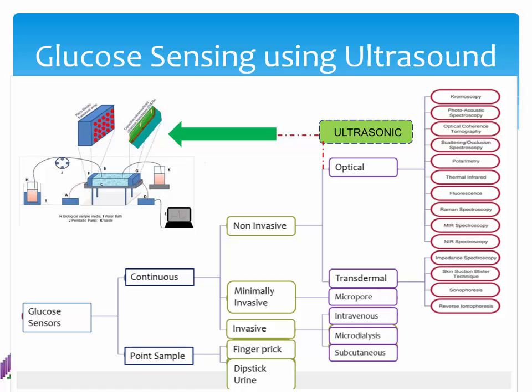So this is essentially the first step towards maybe ultimately integrating this in a form that might be used for continuous sampling, and really, as I said, is a proof of concept demonstration of the potential for using ultrasound-based techniques in a scalable, miniaturized format for glucose measurements that potentially might overcome some of the issues with these other techniques.